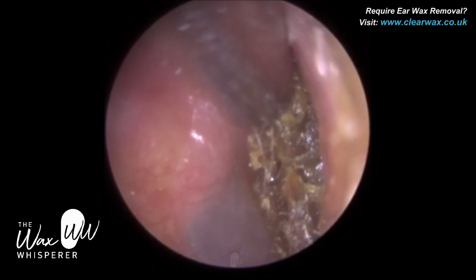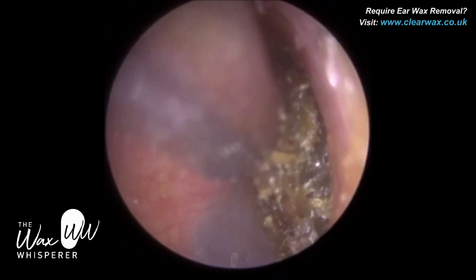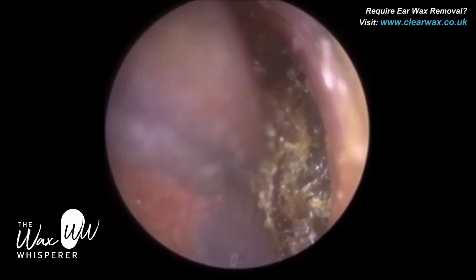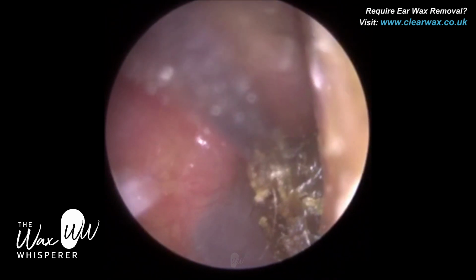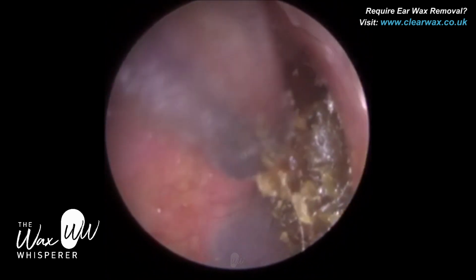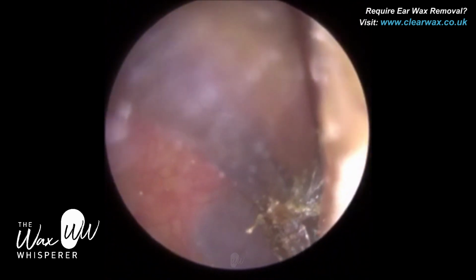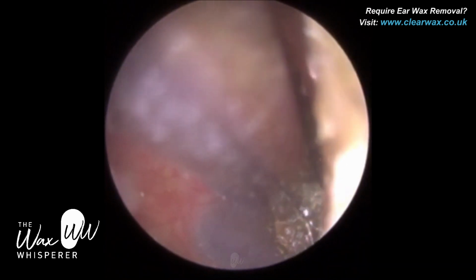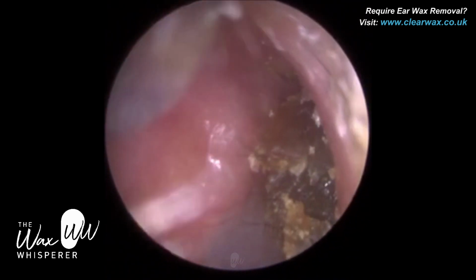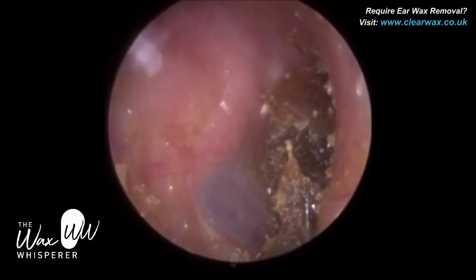So just going back to the isthmus, we have a natural narrowing about 0.5 centimetre away from the eardrum, and then the ear canal protrudes back outwards again. That creates recesses. We normally get 2 recesses. We get one anteriorly, so the front part of the ear canal, where the ear canal narrows and widens and protrudes to the right, and sometimes we get an inferior recess, so at the base of the ear canal near the eardrum. It's like a trench there, and it's probably one of the hardest areas to remove earwax.